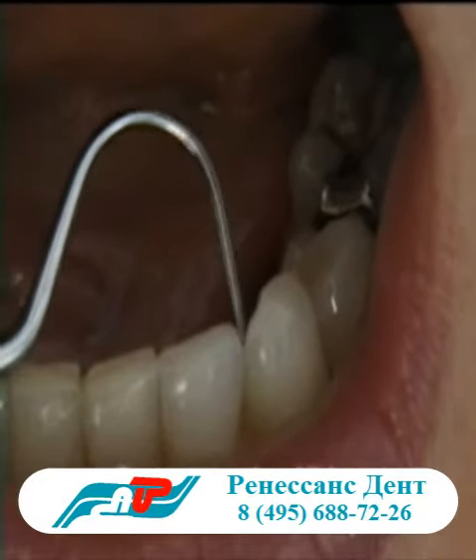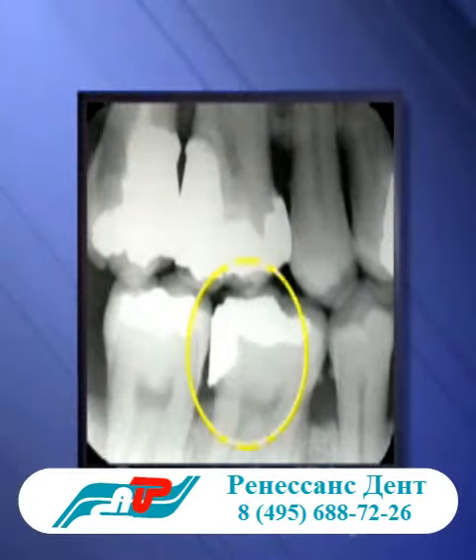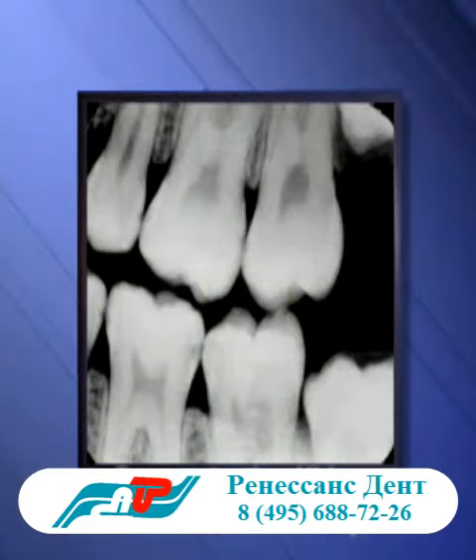We check the tops and sides of your teeth with a dental explorer. To look for cavities between teeth, we use X-rays. Metal fillings and crowns show up as bright white. Cavities show up as dark spots. These small dark spots on this X-ray are cavities.